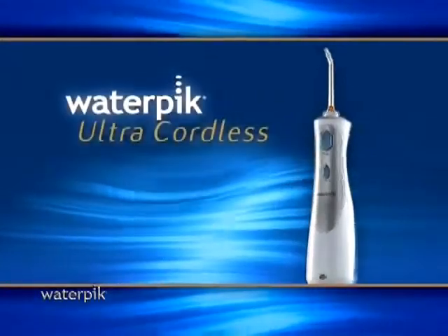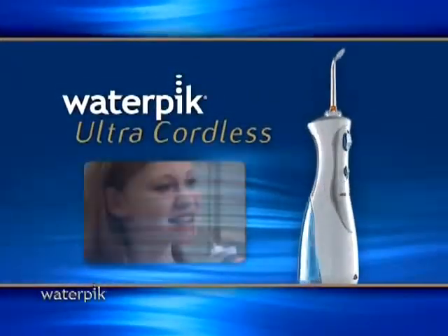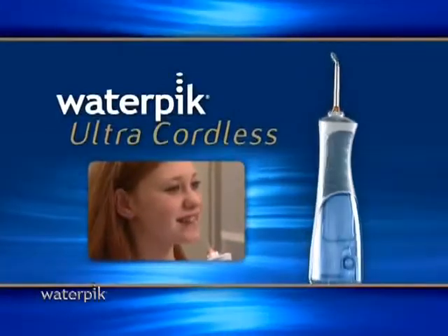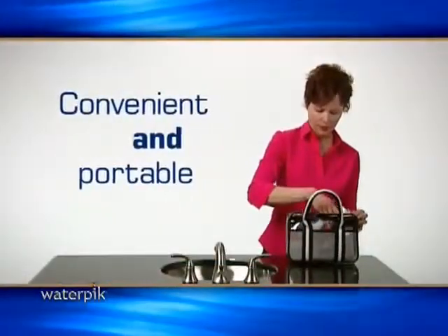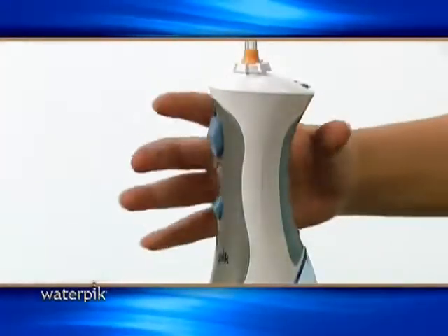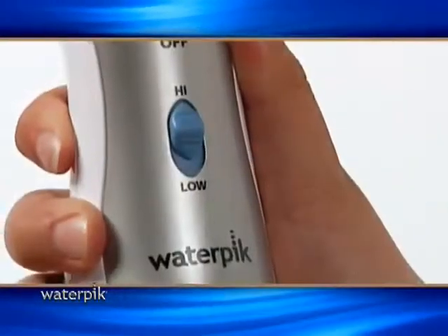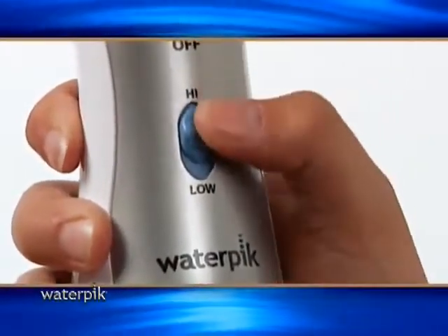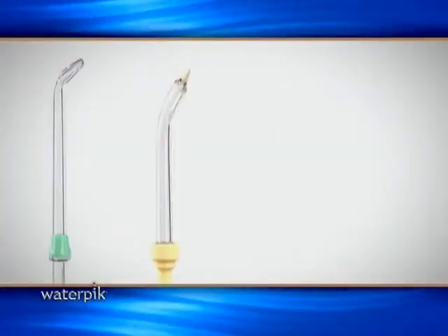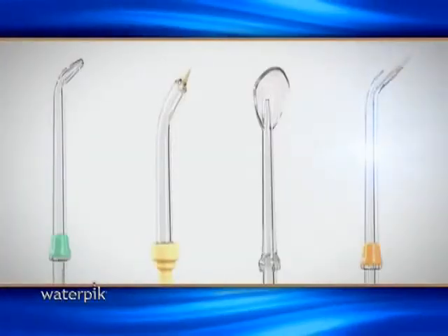Introducing the new Ultra Cordless Dental Water Jet. The new Ultra Cordless is ideal for patients with braces or any patient that wants the convenience of a portable dental water jet. The advanced ergonomic handle easily fits a young person's hand and a dual pressure control system easily adjusts to the desired cleaning level. The Ultra Cordless comes with four tips including the new orthodontic tip.